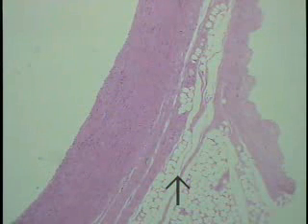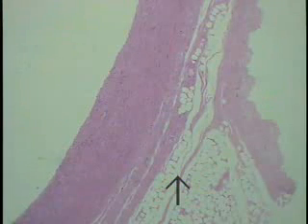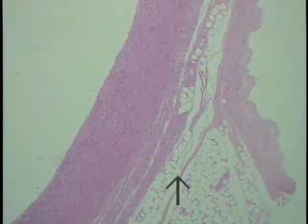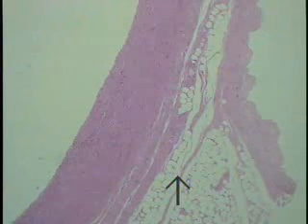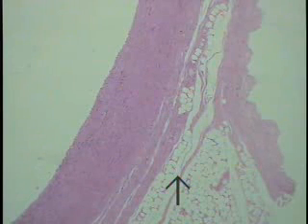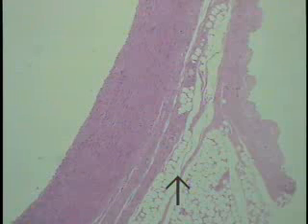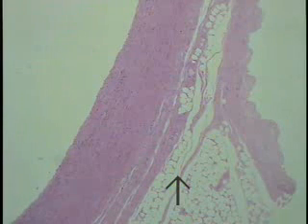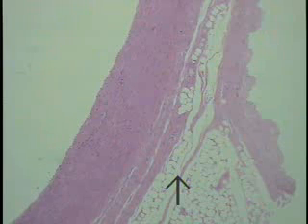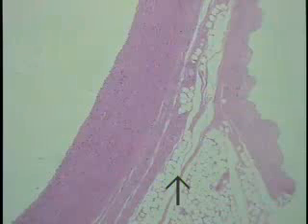Having completed an examination of the heart, begin an examination of the blood vessels, beginning with the arteries. Remember the three layers. The tunica intima of these blood vessels corresponds to the endocardium of the heart. The tunica media is equivalent to the myocardium of the heart, and the tunica adventitia corresponds to the epicardium of the heart, but lacks the mesothelial covering.